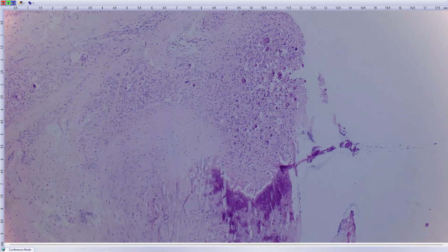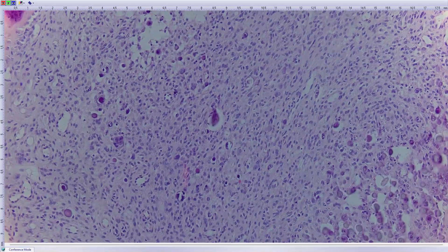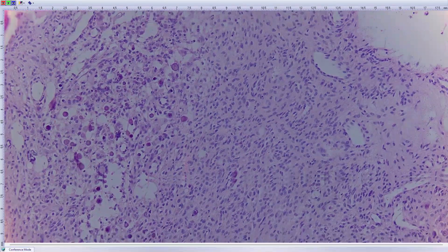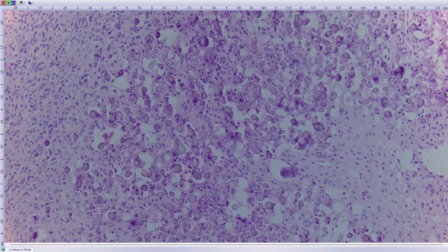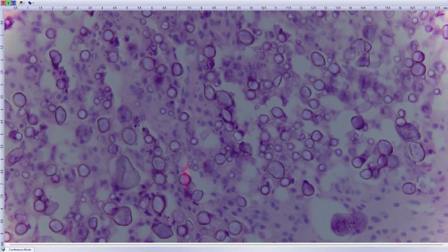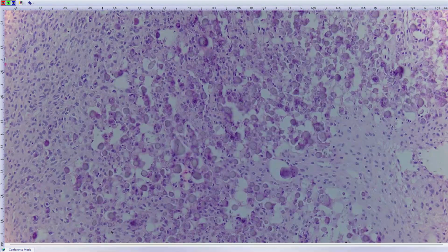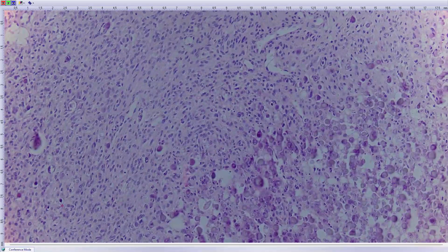You can see here the overlying skin, and in the dermis and maybe superficial areas of subcutis, you see this proliferation of epithelioid cells, which are, however, pretty much bland. There is not much mitotic activity. And what is highly suggestive of the diagnosis are these beautiful psammomatous calcifications. It's not a papillary thyroid carcinoma metastasis. If you stain these cells for histiocytic markers, you will confirm these are all histiocytes.